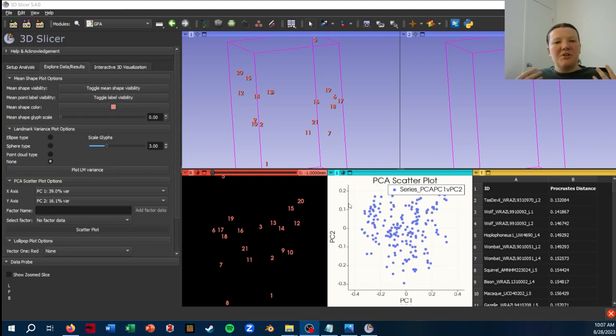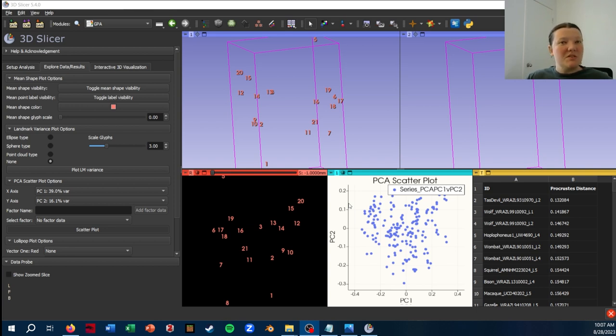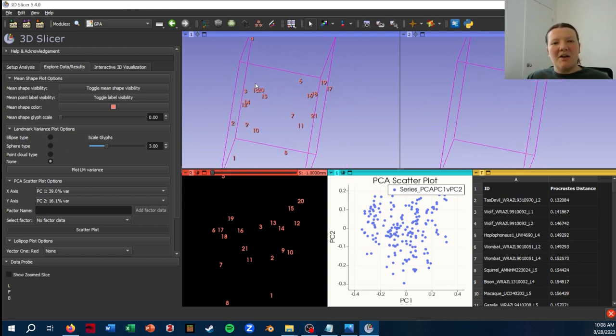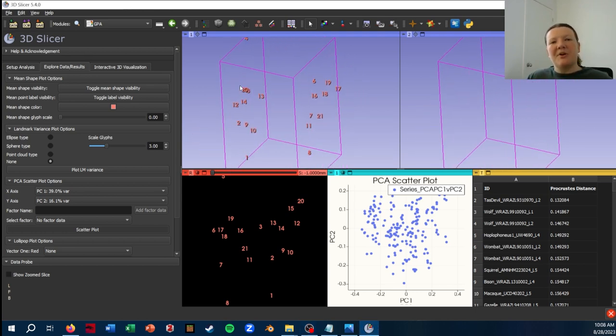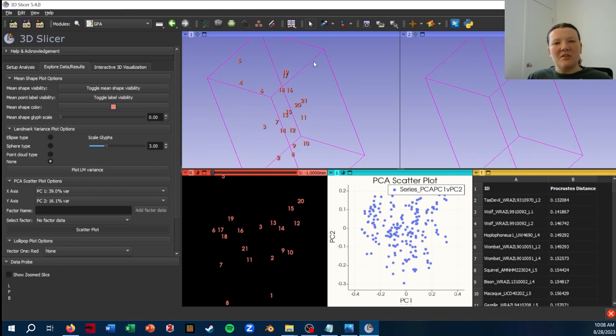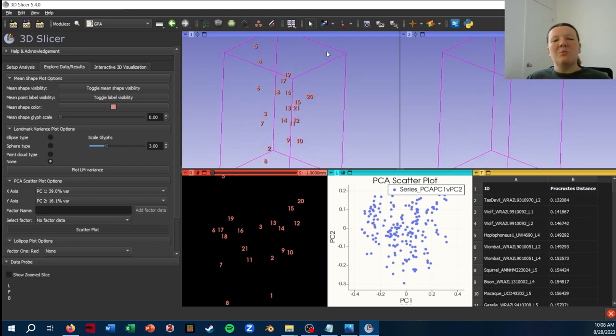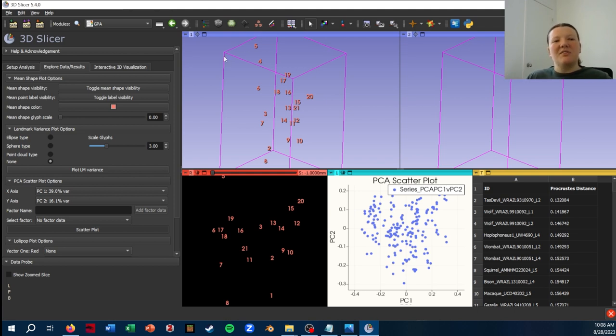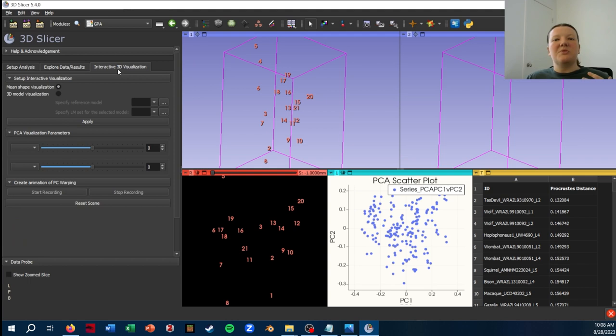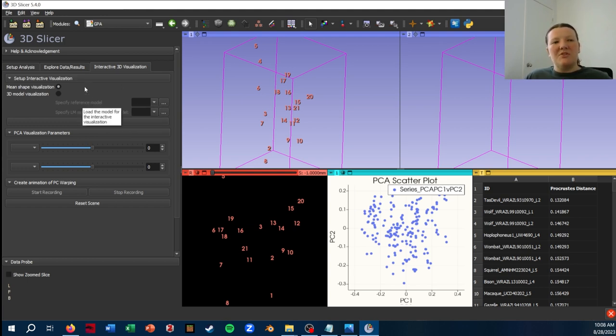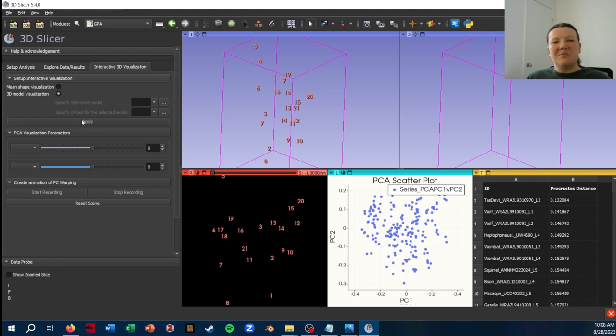Alright. So I've showed a few ways to visualize the shape differences along the different PCs. But especially looking at this, I know this is a vertebrae, but no one else looking at this knows that this is a vertebrae. It's really hard to intuit from what I've shown so far. So now we're going to be looking at the interactive 3D visualization, which is a super cool feature that lets you really intuitively visualize these shape differences.